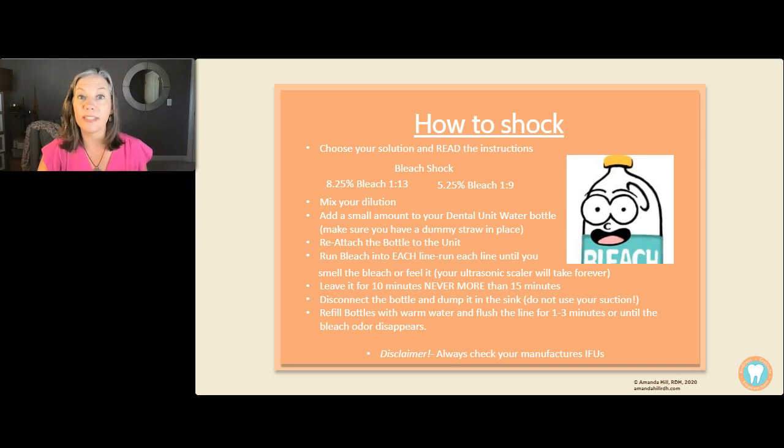Recently, when my office failed, I did a bleach shock because you can do it in about 20 minutes. We'll talk about other products that take a little bit longer. But really what you want to make sure that you're doing when you're shocking is that you're shocking every single line that has water. So that means your power scaler, your air polisher, your air water syringe, any handpiece, tubes that have water in them. You want to make sure that you're shocking all of them, because they all will have biofilm.